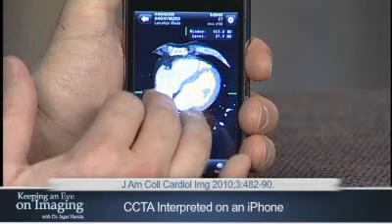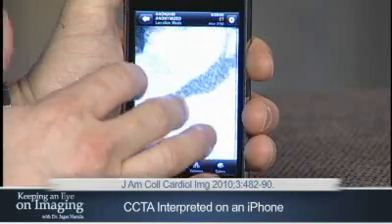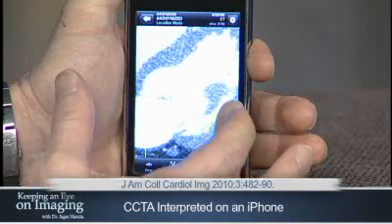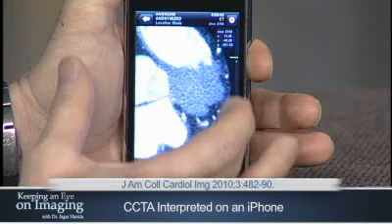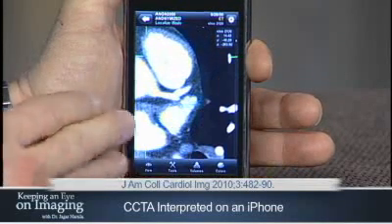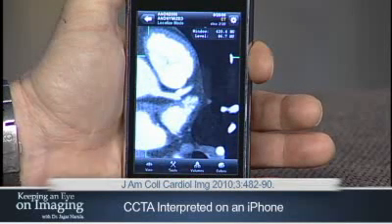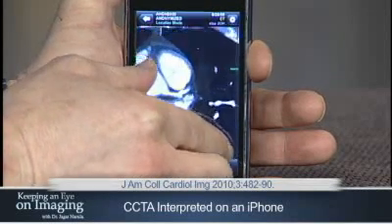By using two fingers and moving them up and down or left and right, I can change the window width and level. I double-tap to zoom in on the area I want to select, move my finger to pan the image, and by putting my finger on the right side of the screen I can scroll through the axial images. I'll scroll up to demonstrate some mild disease in the proximal left anterior descending artery with a calcified lesion. By pinching my fingers together I zoom out, and by pinching away I zoom in.